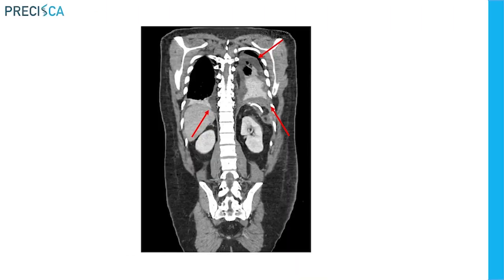Now, lastly, I'll show you what it would look like on a CAT scan. Now, on a CAT scan, the patient is not standing, they're lying on the table. And this image is obtained to orient you. The head of the patient would be up here. This is their spine, and this is the abdomen up here and the pelvis. And what we see is this grayish area surrounds the lung.